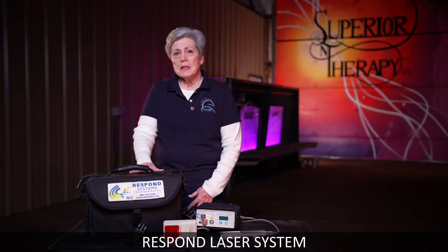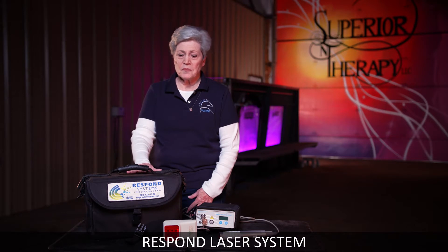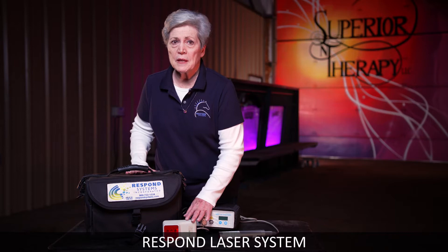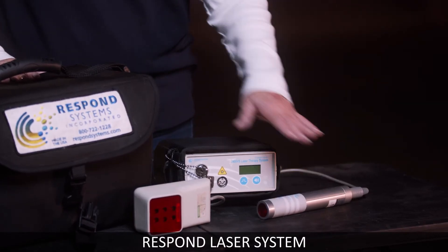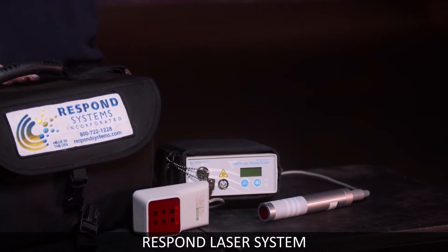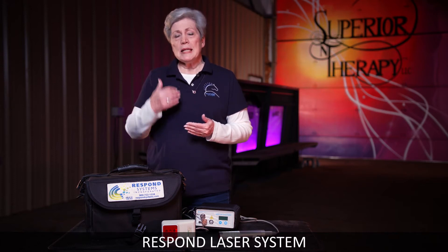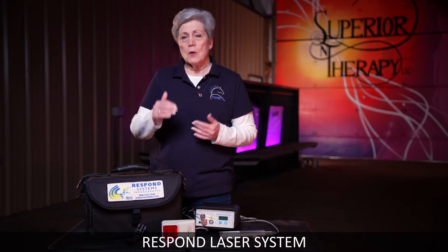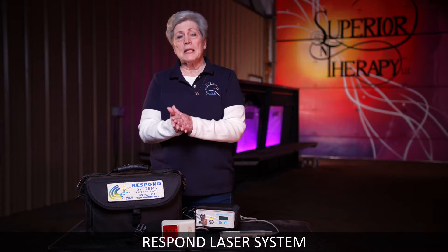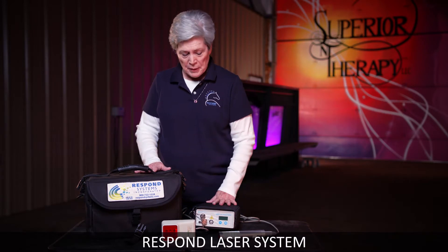There have been no negative side effects from using the Respond Laser. The third thing is that we have two heads to go with it. One is 808 nanometers, one is 904. Why is that so important? That's the exact wavelength to get it to go deep into the horse's anatomy. It's got to get down deep to get to the problem, and both heads deliver that deep penetration.